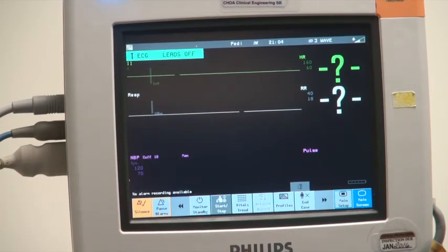And that's something that you can do too. For instance, if you had the cuff on, or you thought you had the cuff on, and you press the start button, and then you want to start over, you can press the start-stop. It'll start it and it'll stop it.